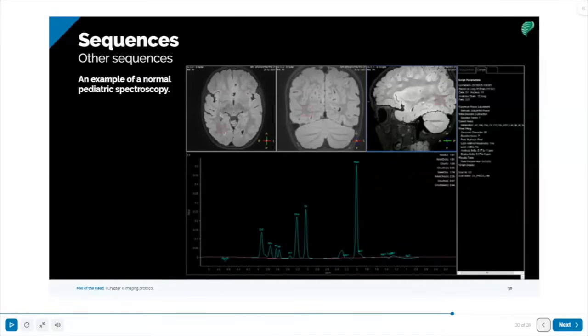When contrast is used in MRI, it's most often used in post-contrast as a T1 weighted. I think we've talked about that, and oftentimes T1 with FATSAT. The contrast media changes the T1 weighting of certain types of tissue and allows for the enhancement of lesions and characterization of tumors and for the detection of inflammatory and infectious processes. 3D imaging is often run in some type of steady state pulse sequence. These sequences are used for high resolution imaging of the cranial nerves and inner ear structures. 3D sequences can provide detailed visualization of the cochlea, vestibular apparatus, and cranial nerves 7 and 8.